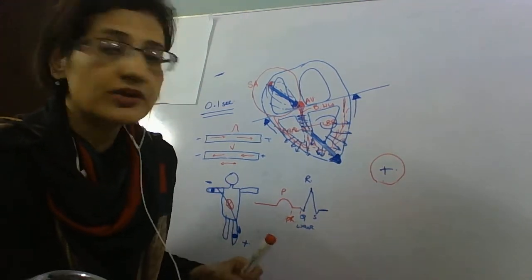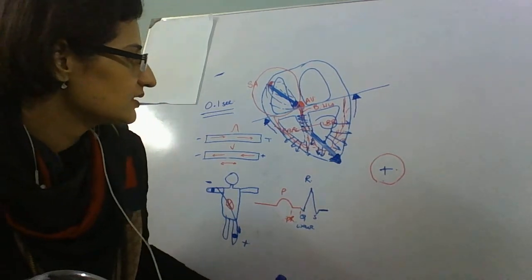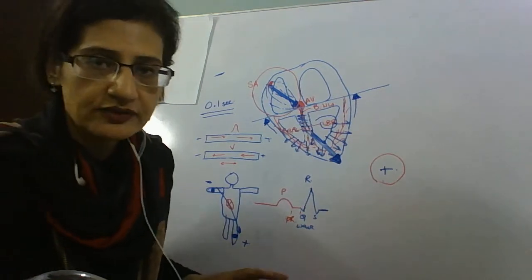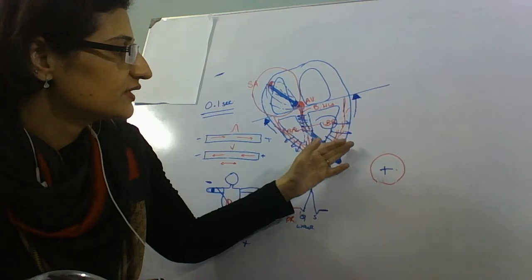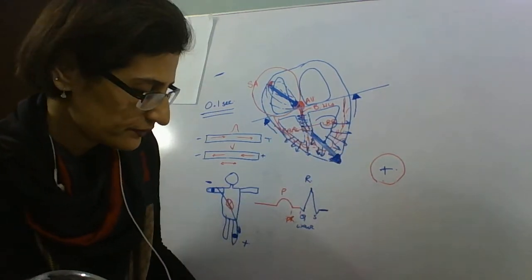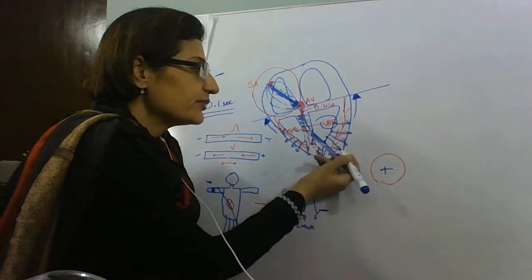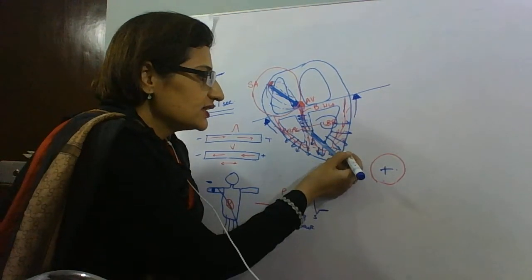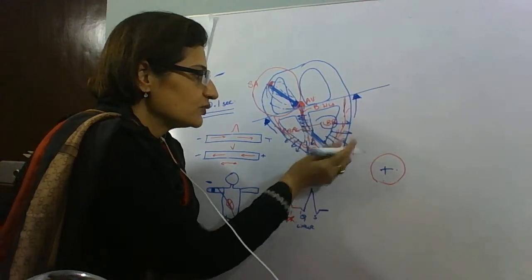The last part of the ECG waveform. What has happened till now is that all the wall of the ventricles have depolarized, and there is a period when all the positive electrodes have come to the outside, and there is a gap. Next is that the ventricle has to repolarize, right? That means the negative have to go inside. So negative going inside, negative going inside.